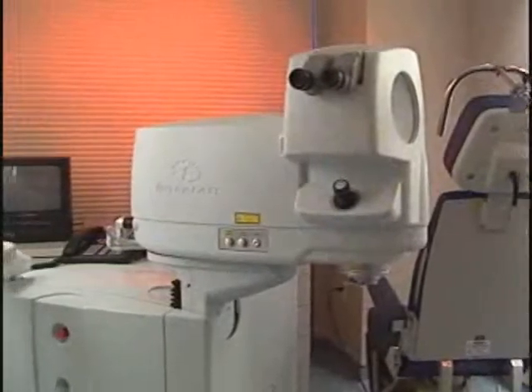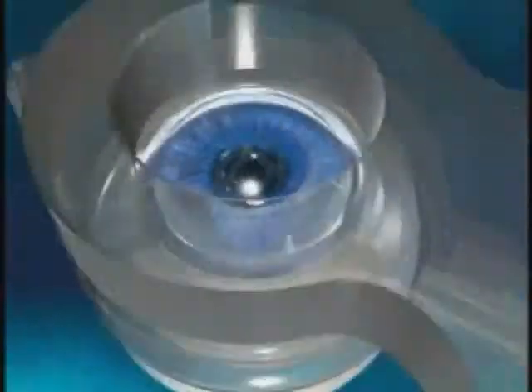For those patients opting to have their cornea flap created with Intralase, the procedure will be slightly different, since the 2 steps will be performed in different rooms. After meeting with the surgeon, we will bring you into the Intralase suite. There, we will clean and numb your eye with topical anesthetic drops. Each flap creation will take approximately 2 minutes.